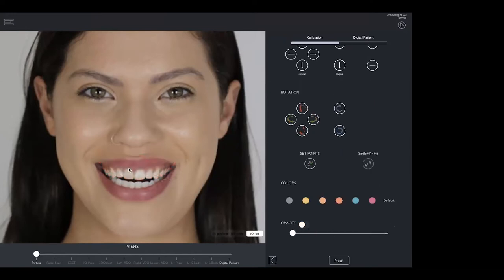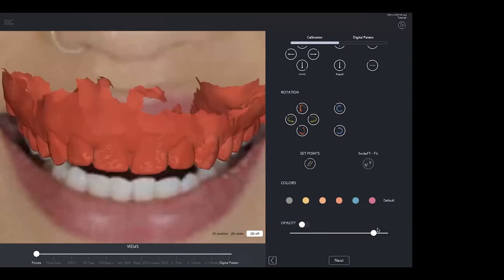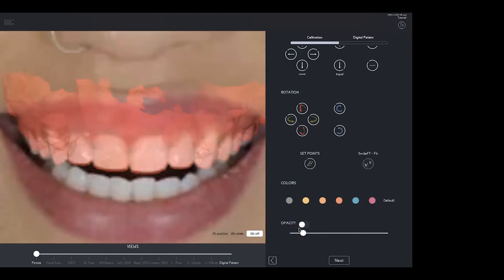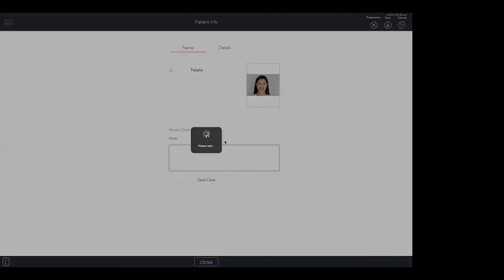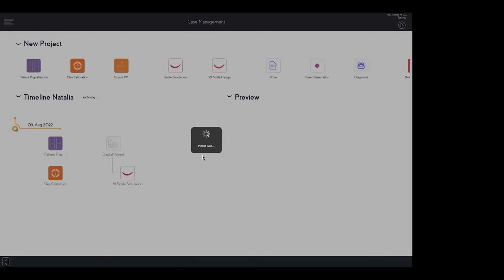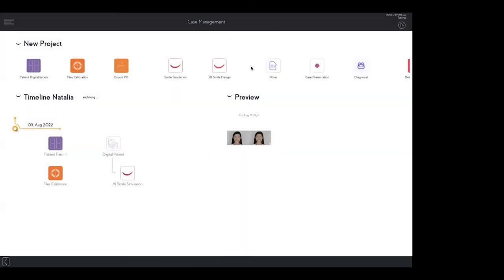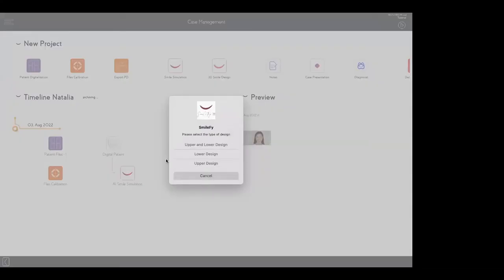Not only that, but if I have my intraoral scan, I'll be able to visualize everything — even if the lip is covering — such as the patient's cervical margins on the central incisors. Now that I've calibrated my files, let's begin our 3D smile design. I'll select 3D Smile Design, upload the patient's files I already have, and you can do an upper and lower dental wax-up, just the lower, or just the upper. Today I'll show you the upper dental wax-up, so I select Upper Design.